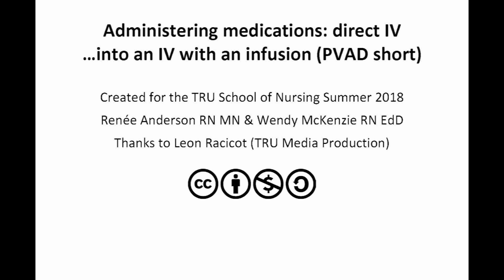Hello everyone, today here is Arin Usama and this video will demonstrate how to give the medication directly in the vein with an infusion or PVAD short.